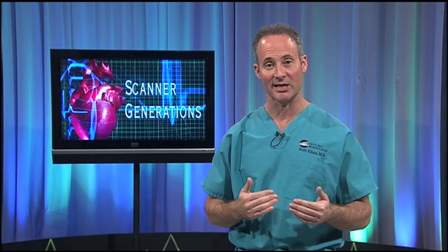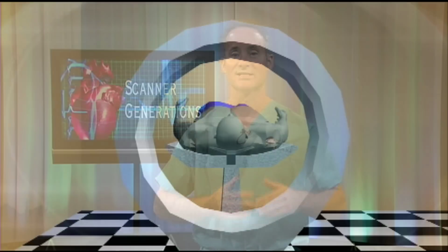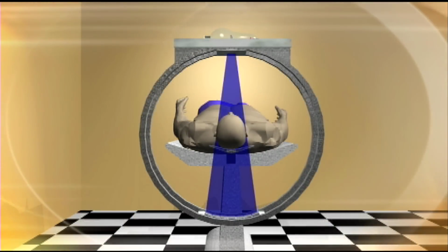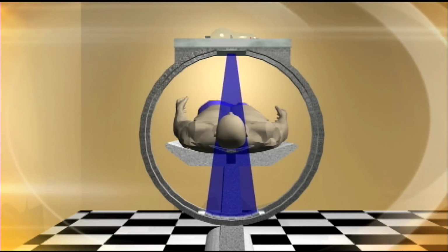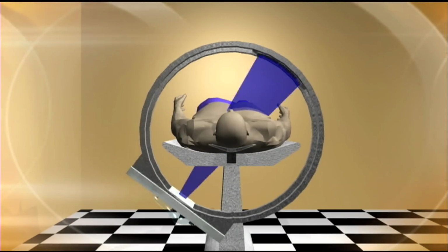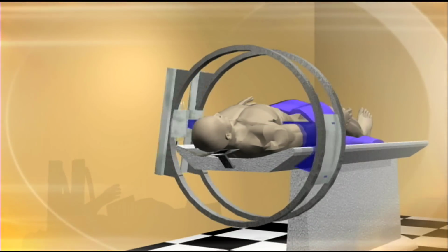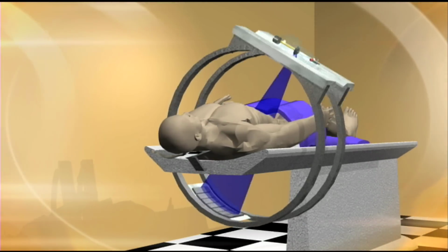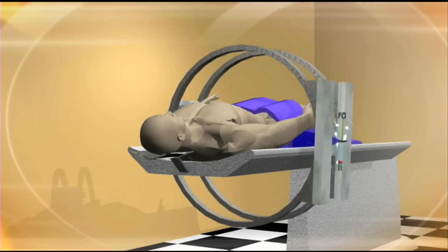The next generation scanners were called helical scanners. Same exact configuration as the third generation. Fan beam configuration of the X-ray source, multiple detectors on the other side, but instead of that 180 degree rotation, you have all the power supply and the electronics connected to a track where you could continuously run in one direction. So now the CT gantry could run in one direction as the body passed through the X-ray source. So there was no stopping and moving the patient through.